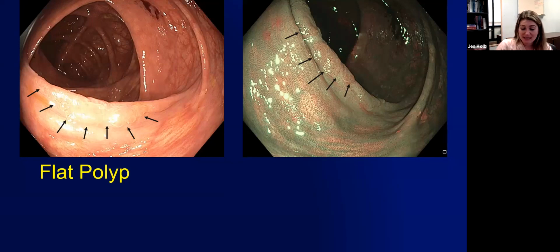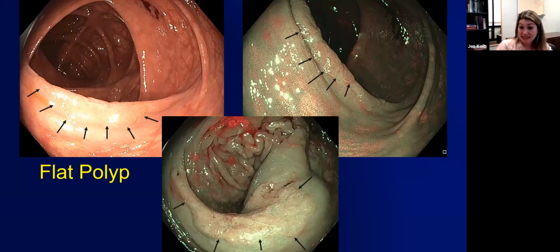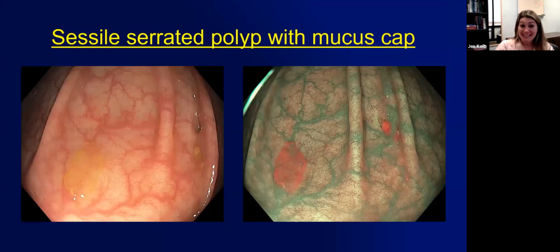Part of the reason I wanted to show you this is because this is a very large polyp, like a 2-3 centimeter polyp. These are the ones that we worry about, the large polyps that are definitely precancerous and will turn into cancer. But I'm not showing you this just to say you need a really good endoscopist. It's actually that you need a really good prep, right? These are exactly what we miss when the patient is not well prepped, because you can see how subtle they are. This is another example of a very subtle polyp where a good prep makes all the difference in the world.